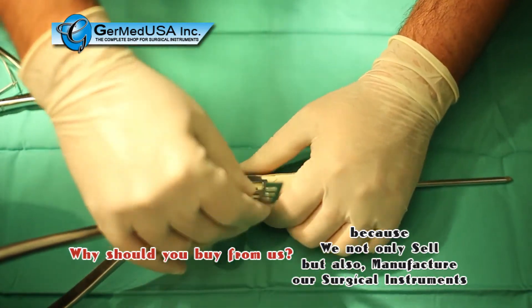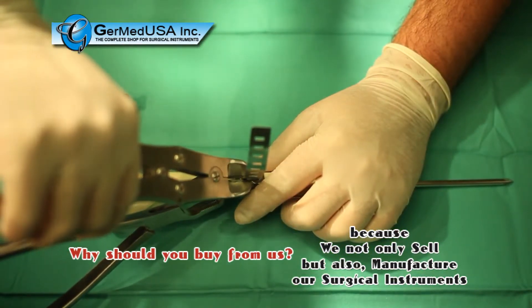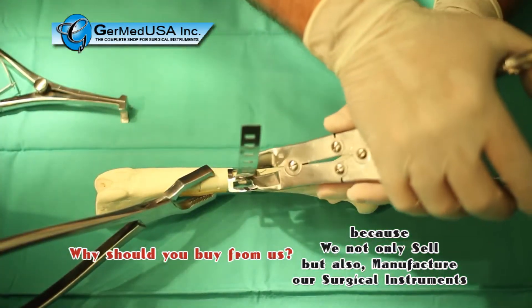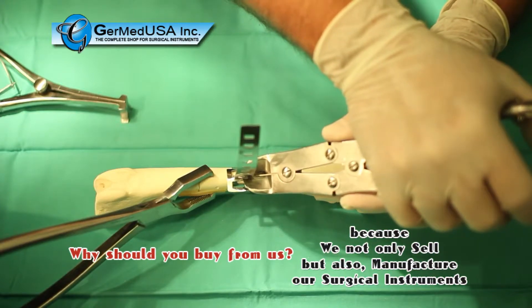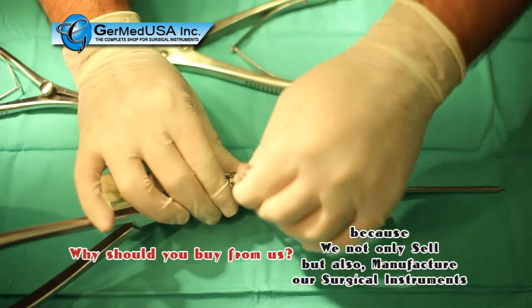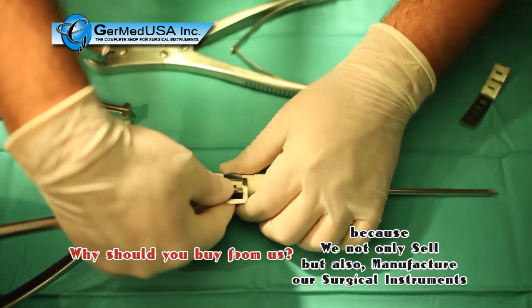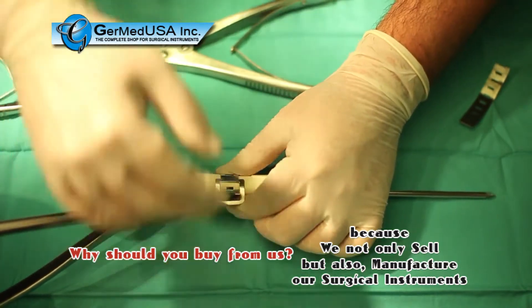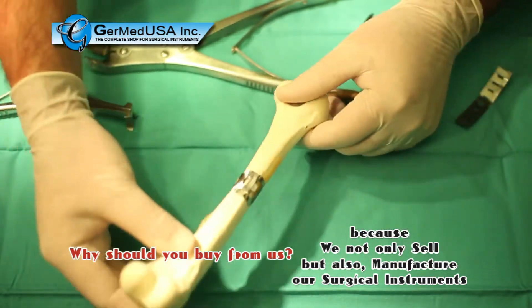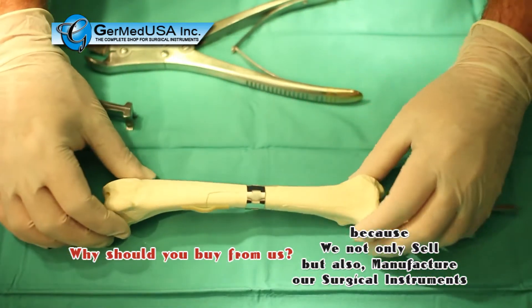The excess portion of the band is trimmed away using either pin cutters or wire cutters. Make the cut at least one slot past the buckle so as not to degrade the integrity of the band. Once the excess is removed, the free end can be pushed closer to the bone for a more low-profile appearance. The final appearance shows that the band and buckle conform to the contours of the bone, allowing for less soft tissue morbidity than a traditional cerclage wire with a twist knot.